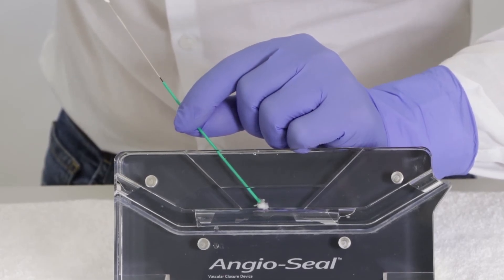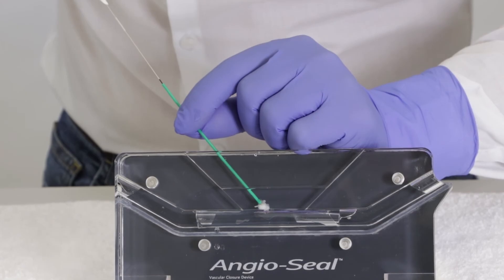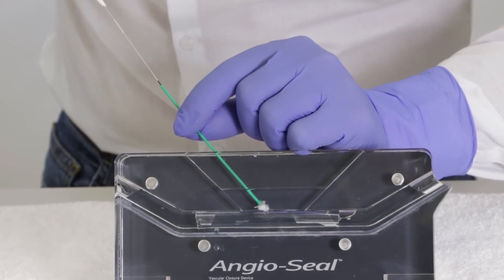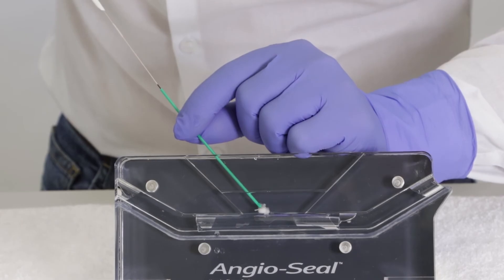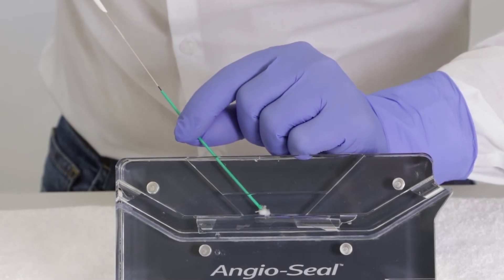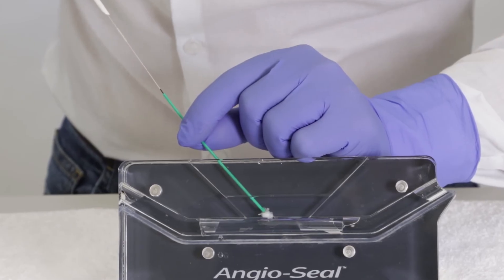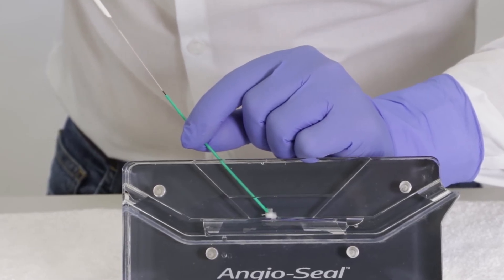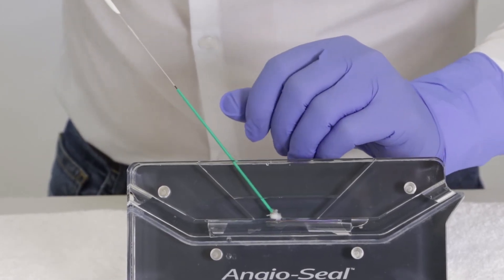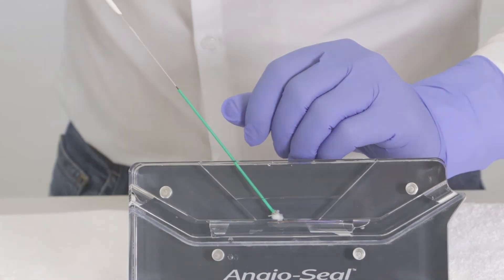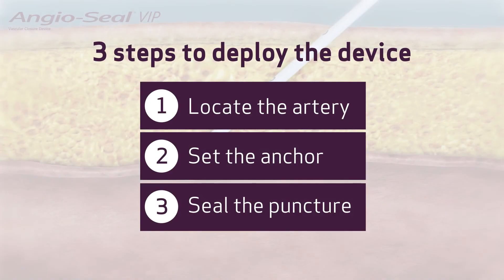The pulling and pushing should happen at the same time. This is called the pull-push technique. The black marker tells you that the collagen is completely compacted down into the arteriotomy. Hold this position for 10 seconds with a little bit of forward compression on the green tube. After 10 seconds you can release the tension. This step is called seal the puncture.